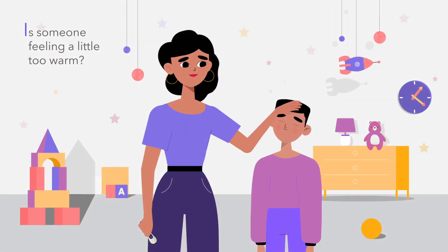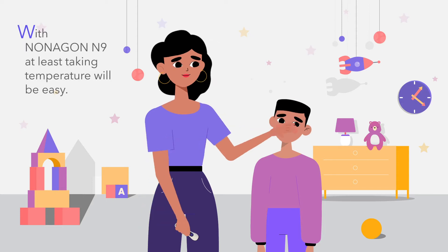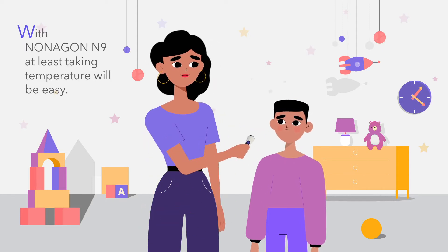Is someone feeling a little too warm? With Nonagon N9, at least taking temperature will be easy.